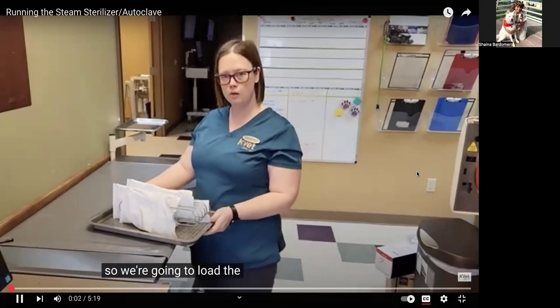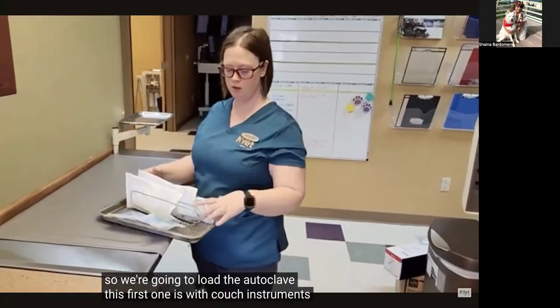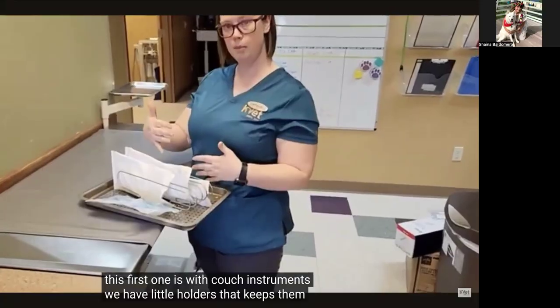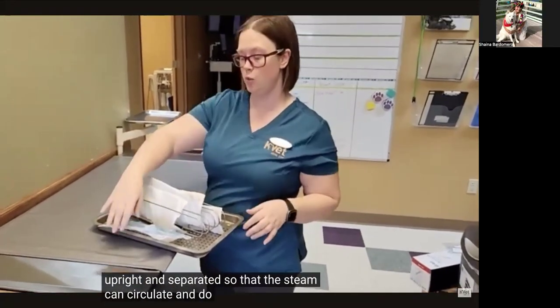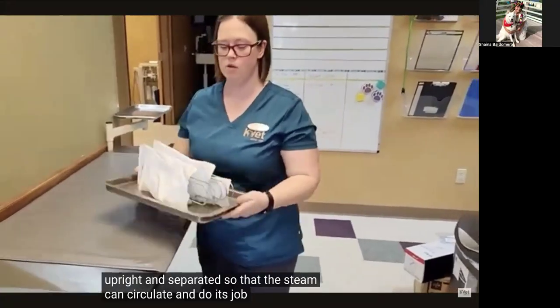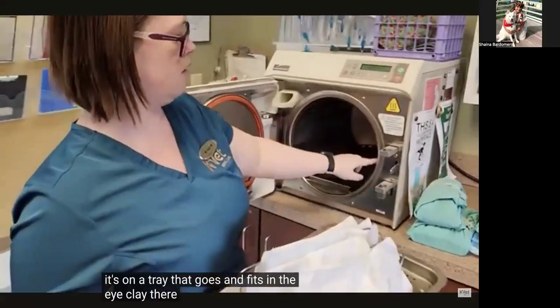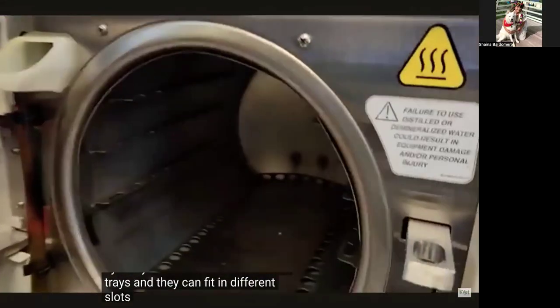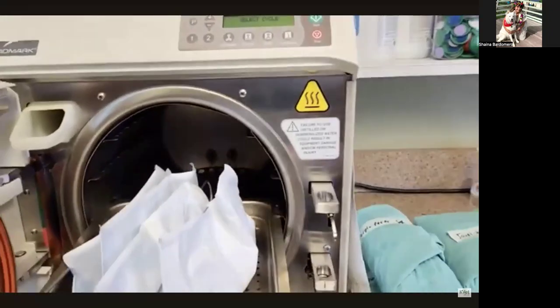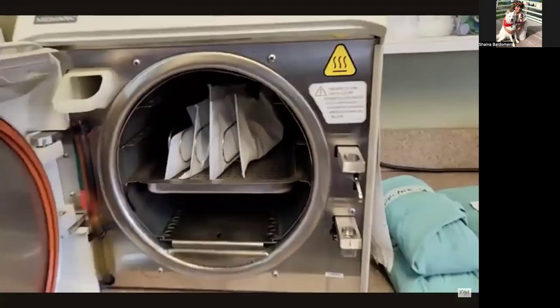We're going to load the autoclave. This first one is with pouched instruments. We have little holders that keep them upright and separated so that the steam can circulate and do its job. It's on a tray that fits in the autoclave. There are different sizes of trays and they can fit in different slots. This is just going to slide right in.